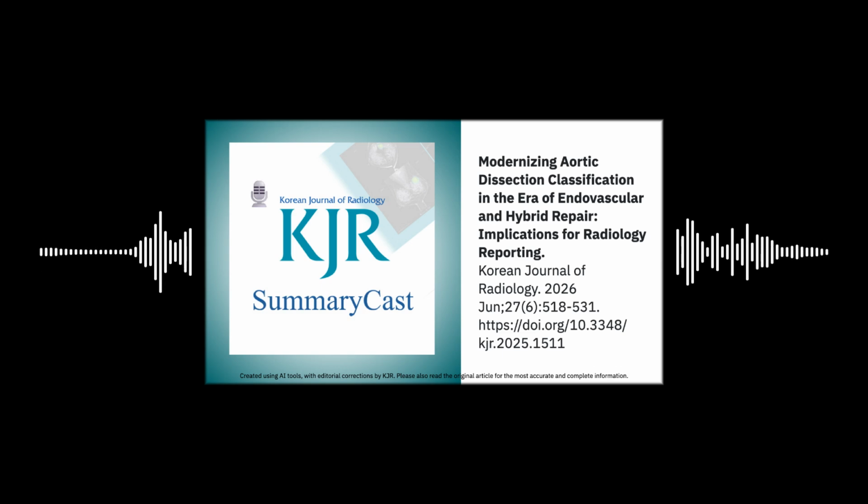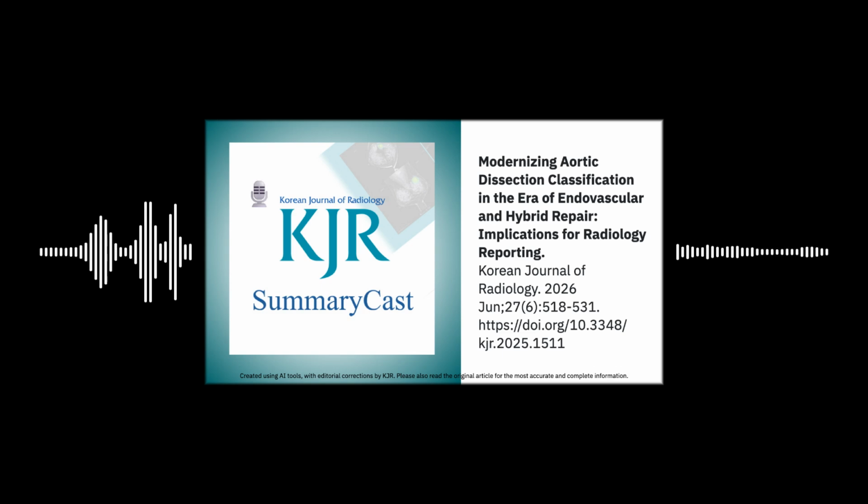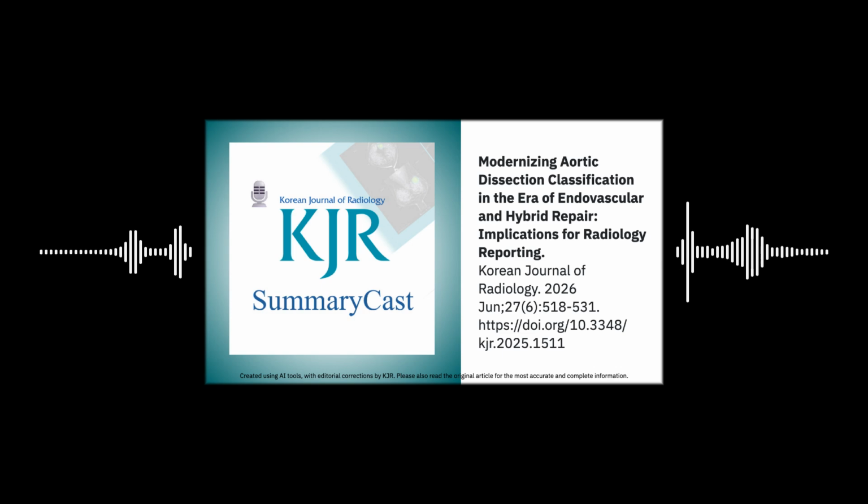So these are signs that even without obvious malperfusion or rupture, the situation is unstable and might progress badly. That's the idea. Features like partial thrombosis of the false lumen or an entry tear on the inner curvature of the arch are also associated with worse outcomes. Reporting these gives the clinical team a much better picture of the patient's future risk. It allows them to consider earlier, proactive intervention instead of waiting for a complication.